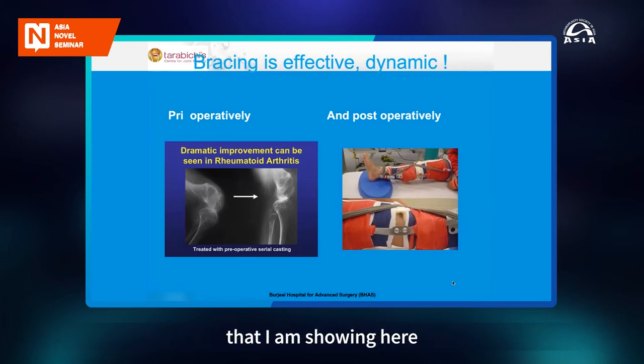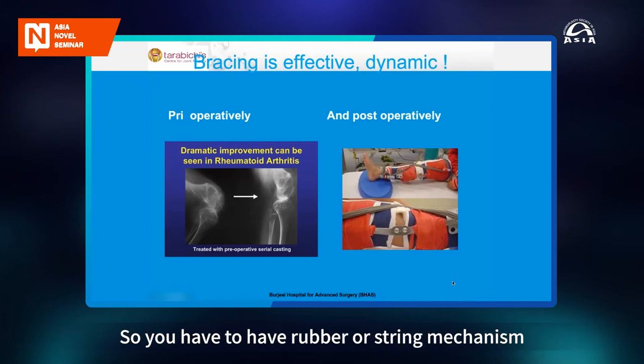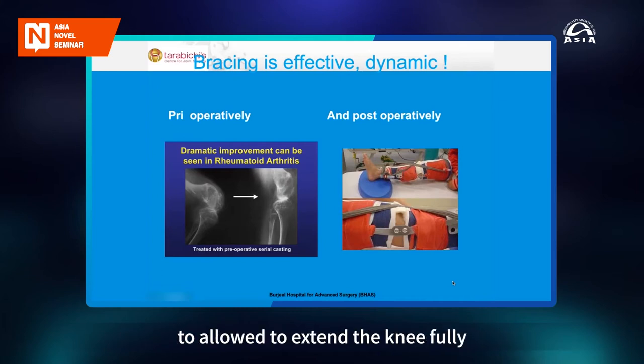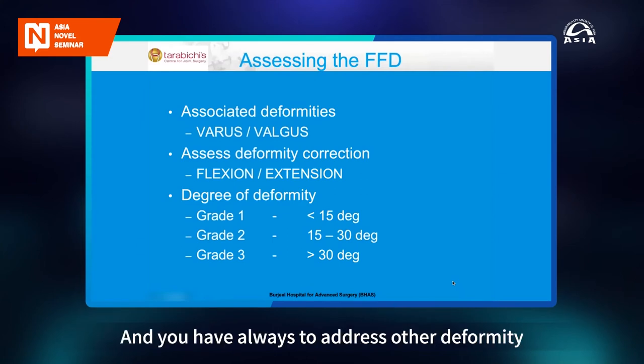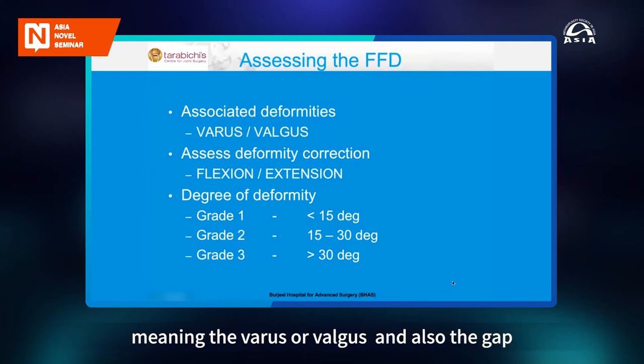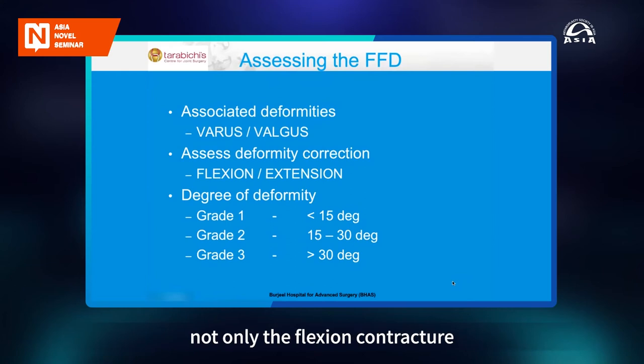Some of those dynamic braces that I'm showing here, where there is a constant pressure to extend the knee, are much better than rigid ones. So you have to have a rubber or spring mechanism to allow you to extend the knee fully. But there are flexion contractures that you're not going to be able to correct, such as the traumatic because of bony malalignment. And you always have to address the other deformity that the patient already has, meaning varus or valgus, and also the gap. So you have to think of the whole deformity, not only the flexion contracture.